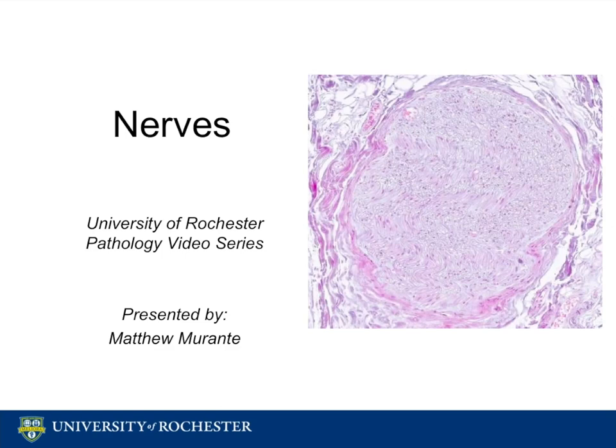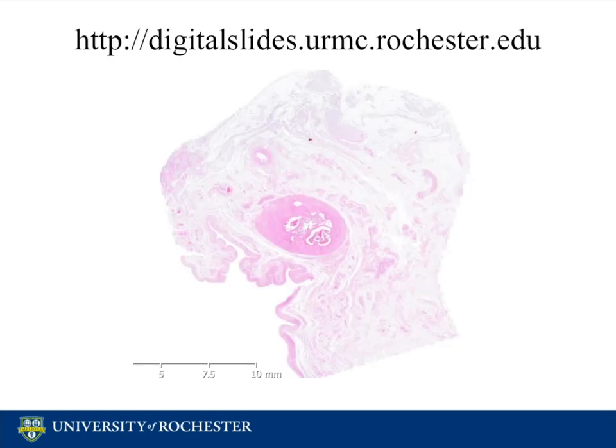Welcome to the University of Rochester Pathology video series. This video reviews the normal histology of nerves. Using the nanozoom digital pathology slides available in the U of R histology folder, we will examine the microscopic anatomy of nerves. Feel free to locate slide 19 and follow along as we explore the spermatic cord cross section, which we will examine since there are abundant nerves in this region.